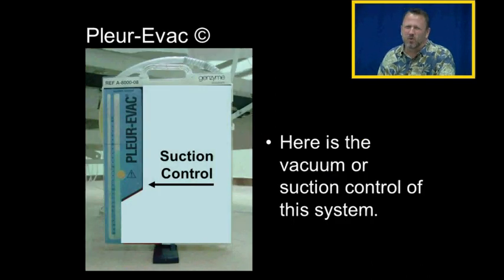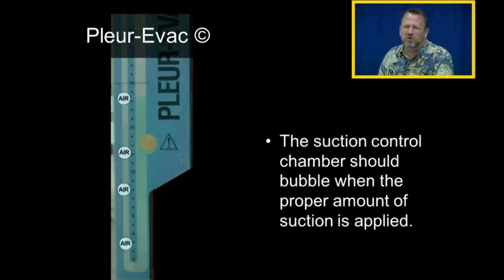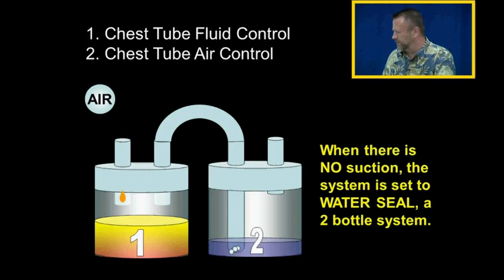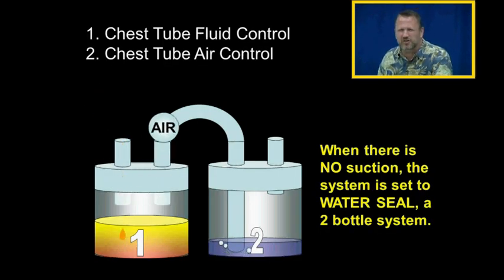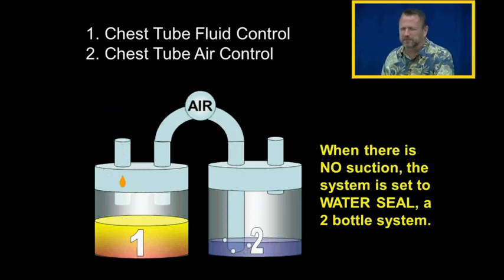So here's the vacuum or suction control of this system. The atmospheric vent of this suction system is usually submerged in 20 centimeters of water. The suction control chamber should bubble when the proper amount of suction is applied to the system. The suction control chamber should not bubble when suction is discontinued. Again, when there's no suction applied to the system, then it's automatically set to water seal, a two-bottle system.